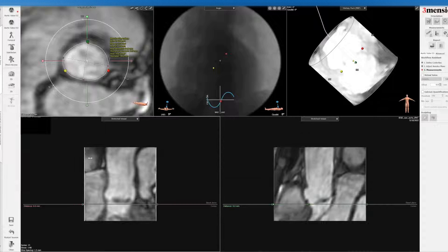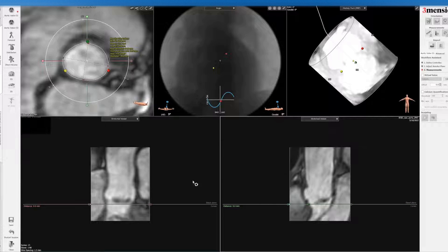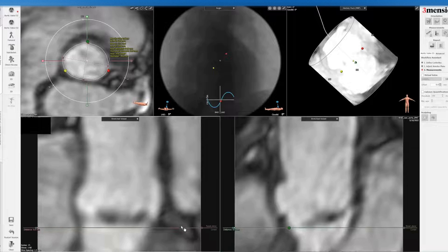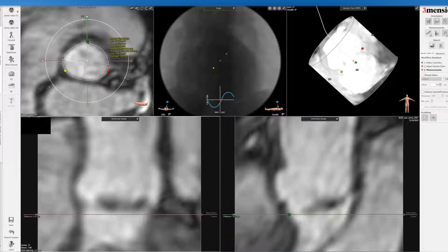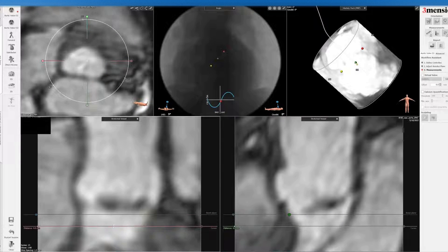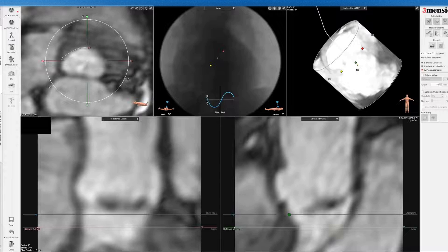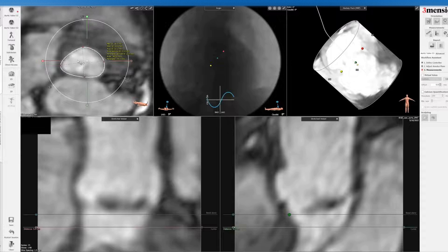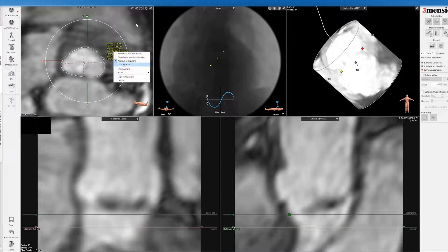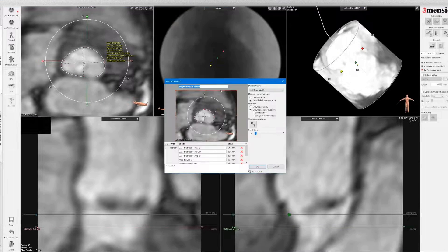Then I'm going to crop close to these two views and then magnify them. Unfortunately, you cannot measure the septal length using MRI — it's just almost not possible. So now I'm at the five millimeter cut doing the LVOT analysis, and I'll save that as well.